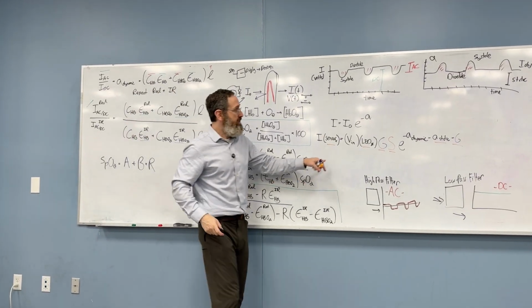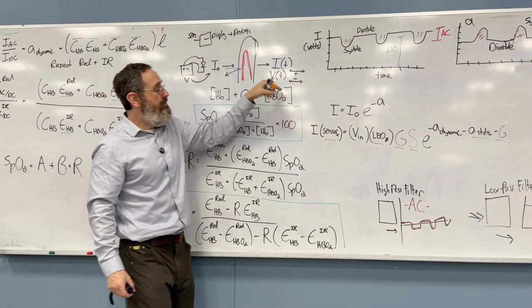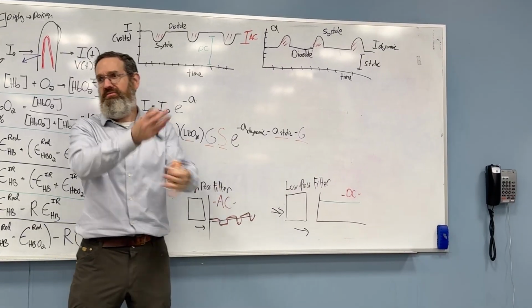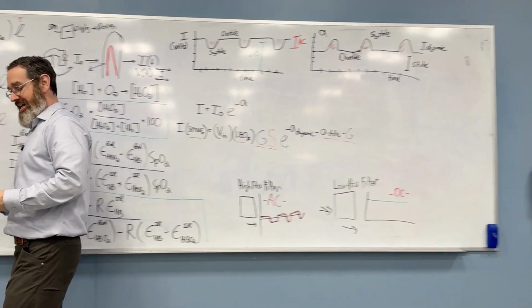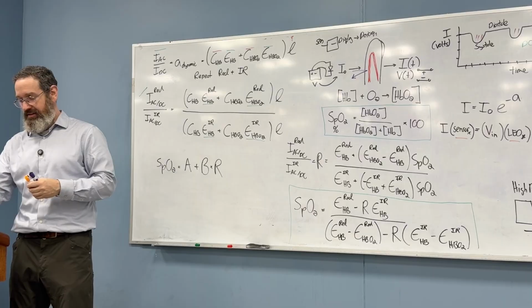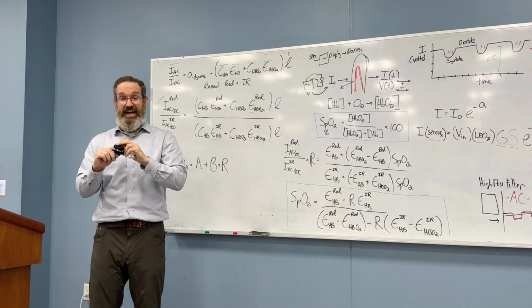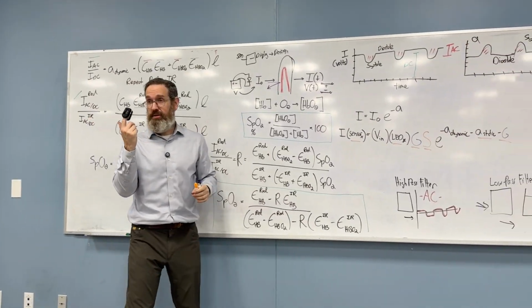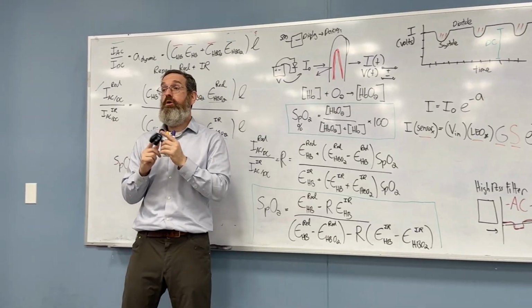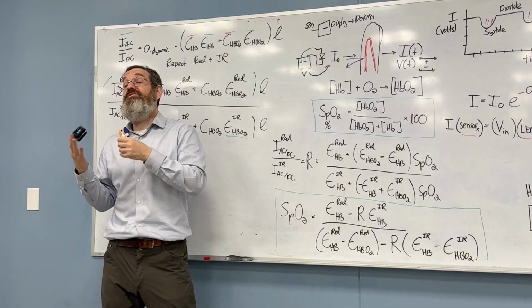If the light was twice as bright, well then this would be twice as bright, and this would be twice as bright, but I'm just dividing them out. And so the fact that we can put this on and tell you with tremendous reliability what your SpO2 is, is a remarkable feat of biomedical engineering, and it's very fortuitous.